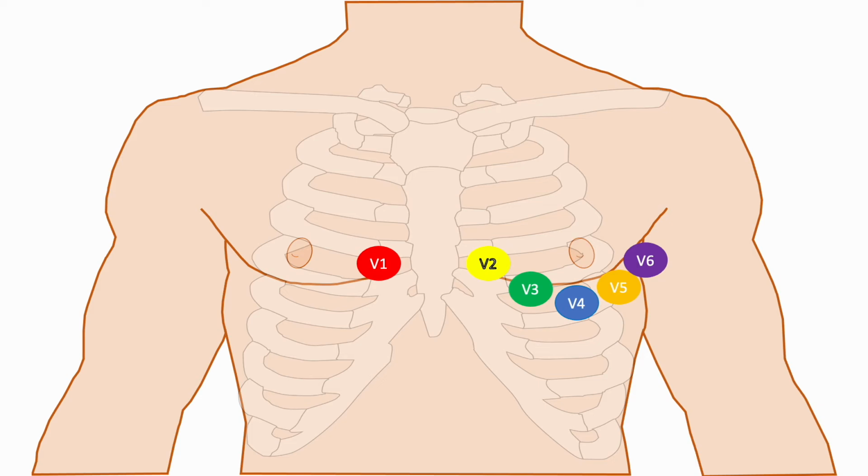Since our leads are in place, let's talk about obtaining the 12 lead. Make sure all the lead stickers are attached firmly and that all the wires are connected to the monitor. Ask the patient to lay supine and remain still. Movement can distort the reading and cause artifact.